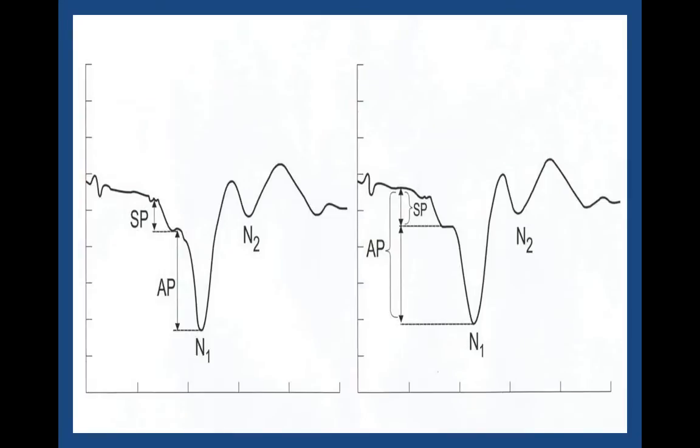Okay. Here are very familiar representations, and these are from our lab, of an electrocochleogram evoked by a click stimulus. This is the onset of the signal, at 0 time. And we see this little blip or shoulder that in a normal ear represents the SP, followed by the onset of the N1, in particular, of the whole nerve auditory nerve response.